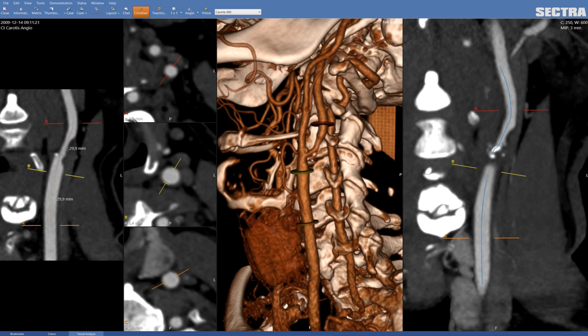You will also have the diameter of the vessel automatically created. If you don't agree with the computer, you can change the diameter by just dragging on the bars here.